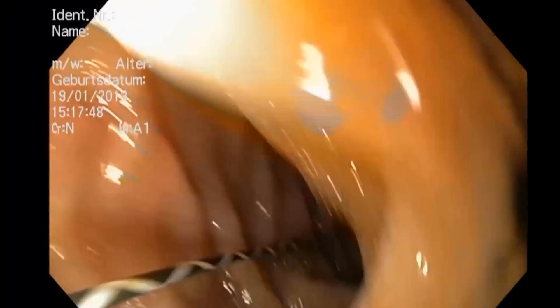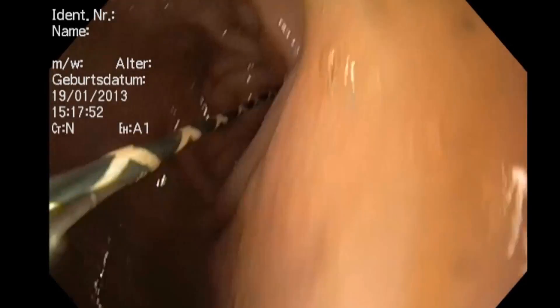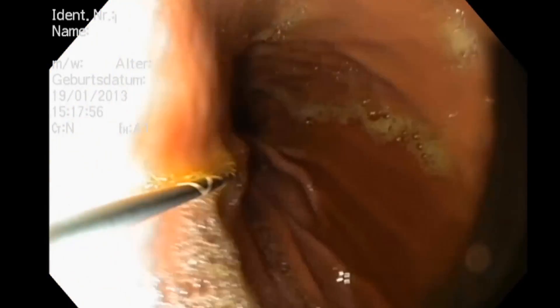In order for this not to happen, the following is done within the scope of a gastroscopy. This time, however, by not using endotracheal intubation but sedation — you pull on a specific retention stitch which is hinged in the nitinol anchor and makes the nitinol anchor collapse. It can then be retracted into a cone guard with the endoscope and safely pulled out through the oesophagus and the mouth.